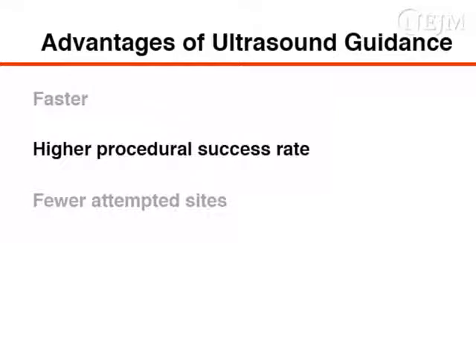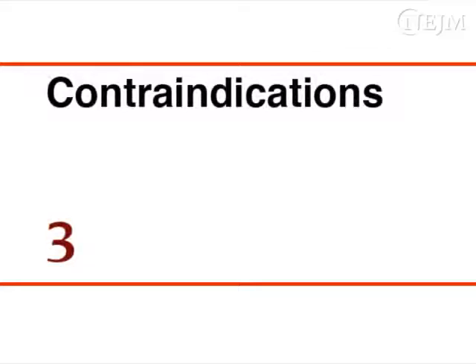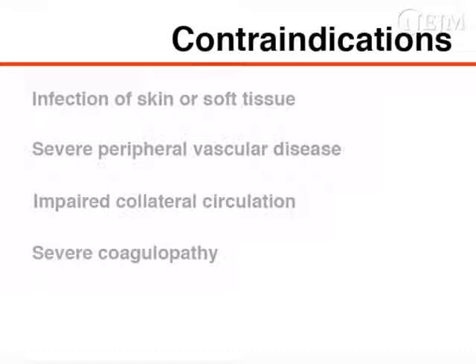Also, successful insertion is achieved after fewer attempts, which means that there are fewer attempted sites of insertion, thereby minimizing patient discomfort. There are no contraindications to the use of ultrasound guidance.